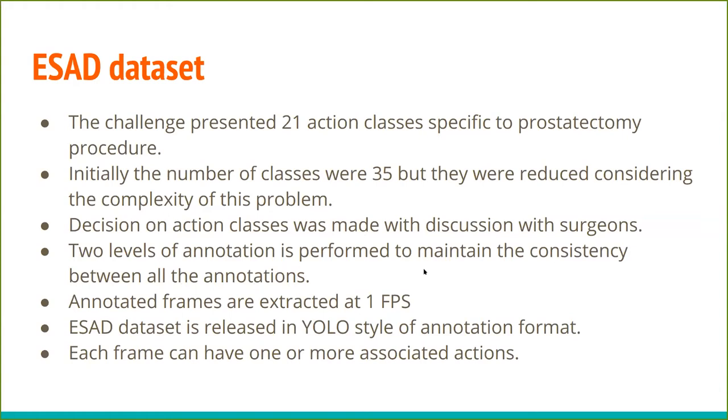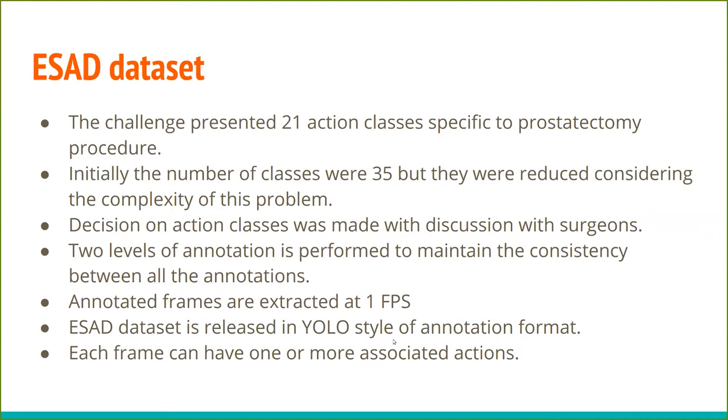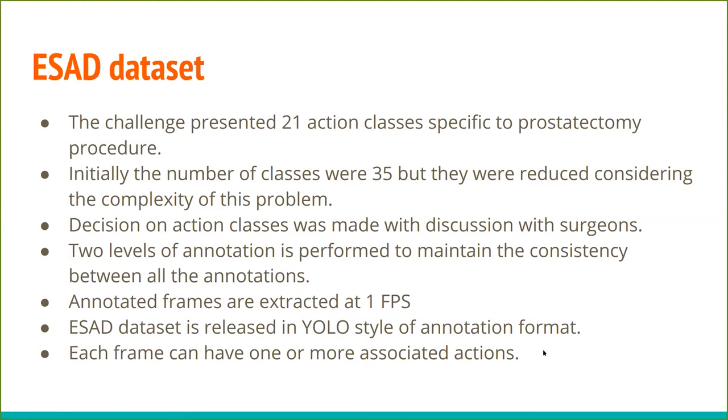For the purpose of this challenge, all the annotations are performed at 1 FPS, 1 frame per second, although the recorded videos from the endoscope were at 30 frames per second. For this ESAD challenge, we use the YOLO style format to provide the annotations of the bounding boxes, which is the center location X, Y, and width and height. And each frame can have more than one label, or more than one action.